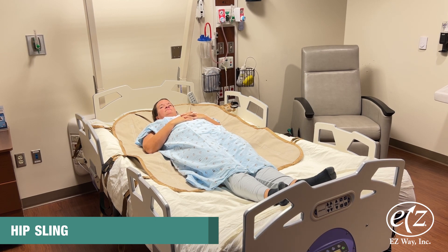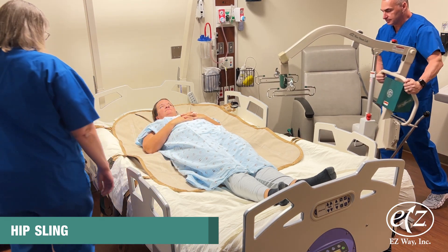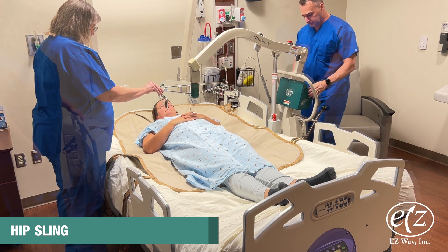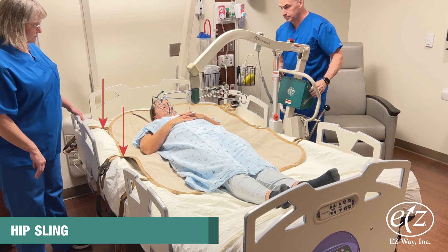Move the lift to the person, making sure the nose of the boom is over the person's abdomen. Lower the lift boom enough to hook up the straps. Note there are three attachment points on each side: head, middle, and leg.